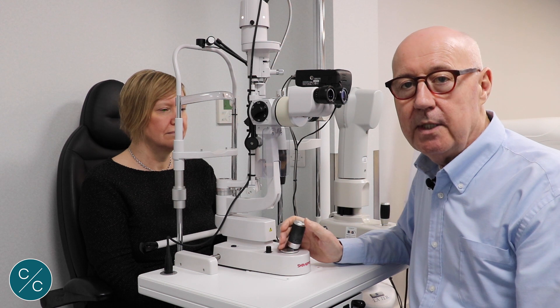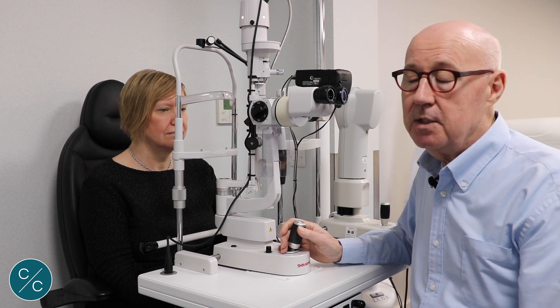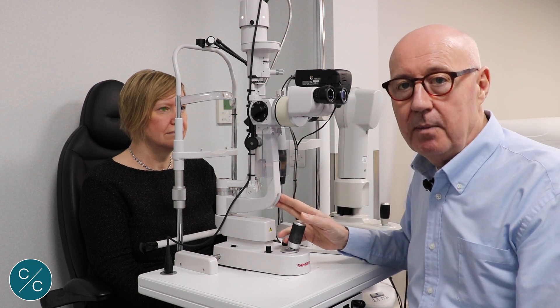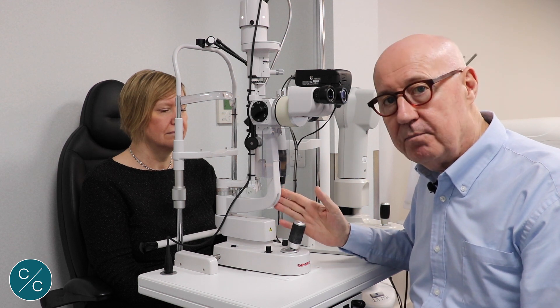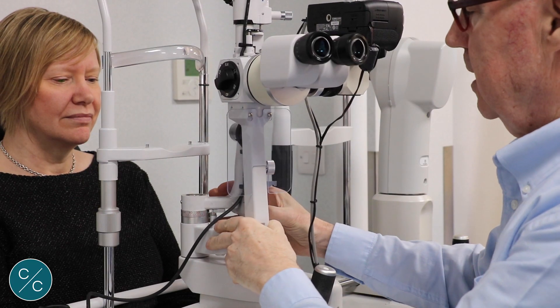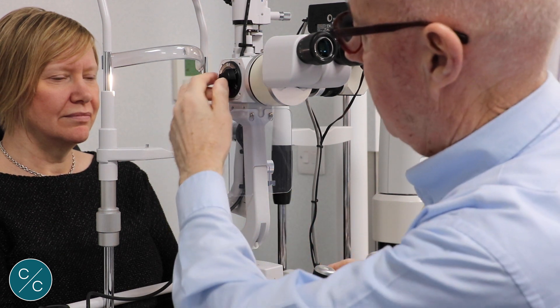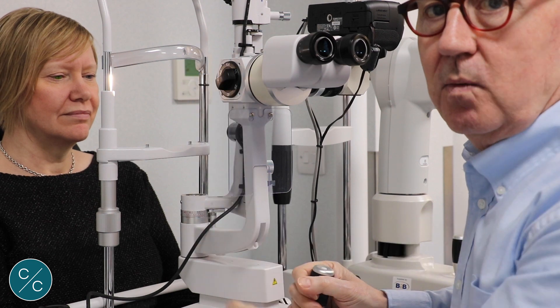When we come to look at the patient under the slit lamp to establish the central clearance, we first of all need to set the slit lamp up. We'll be viewing with white light despite the presence of fluorescence, and we want the narrowest beam. The slit lamp also needs to be set at about 60 degrees from the light source. I also at this stage set the magnification down as low as possible until we're lined up.